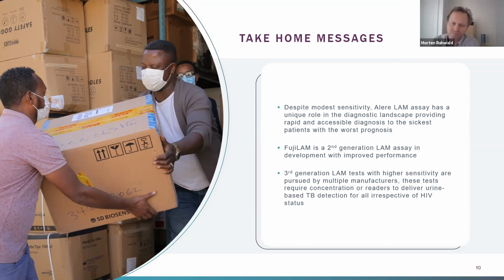But it requires concentration of urine or readers to really deliver this performance. But I think it is practically feasible. And with all the innovations we've seen from the COVID pandemic, I think this is where we will be moving in the next couple of years.